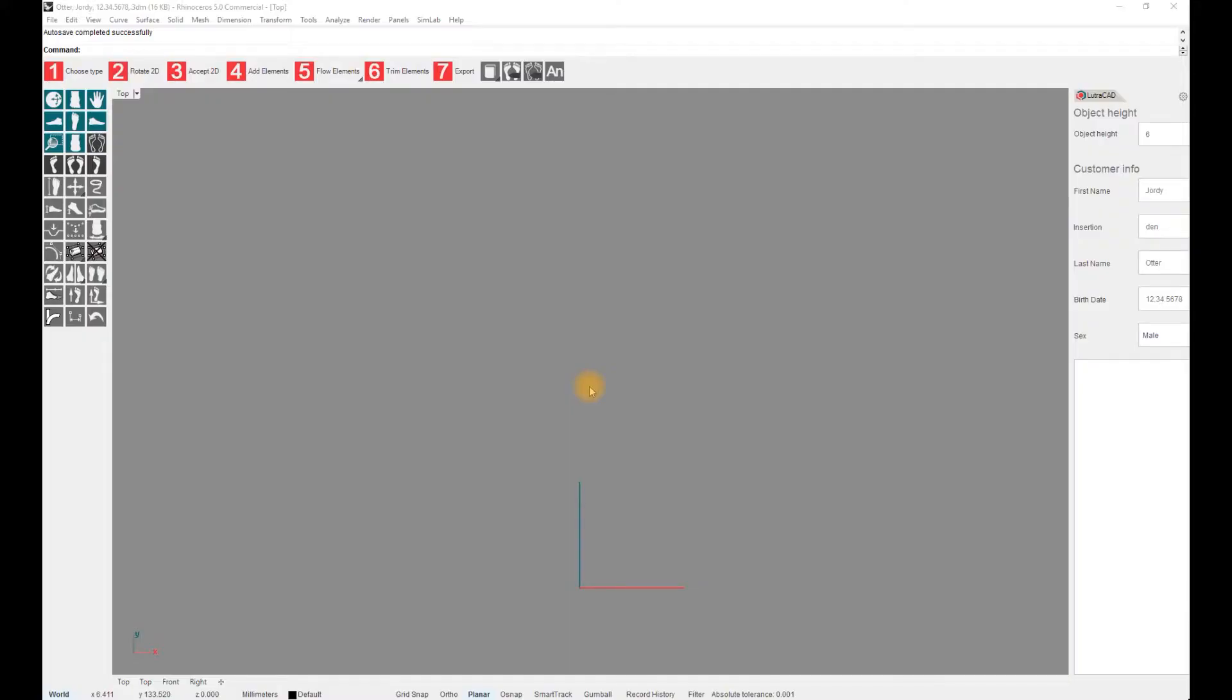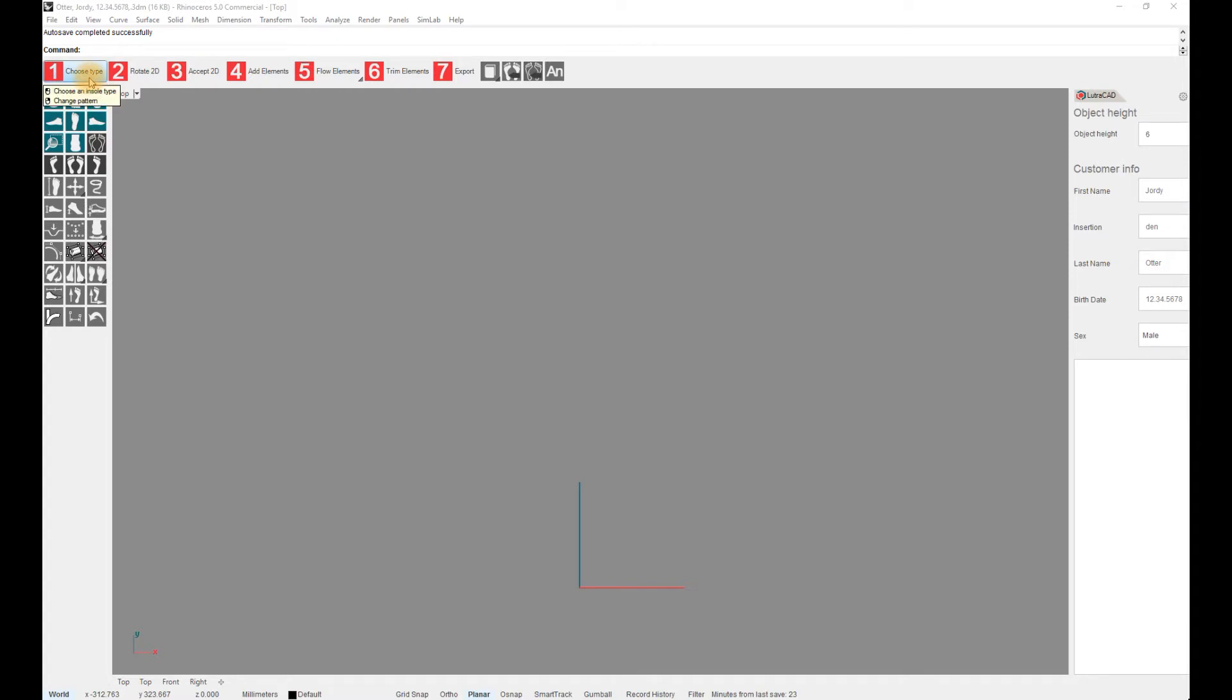You will find the steps needed for designing an insole from start to finish at the top of the toolbar. Now only 7 steps are visible, but this toolbar will change when we have chosen Full Contact Insole.